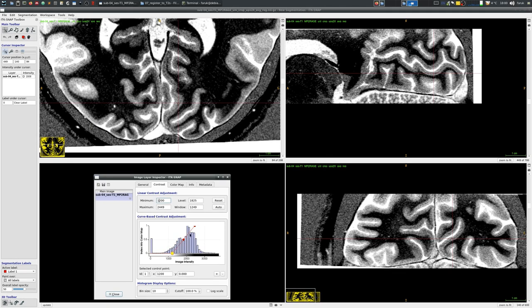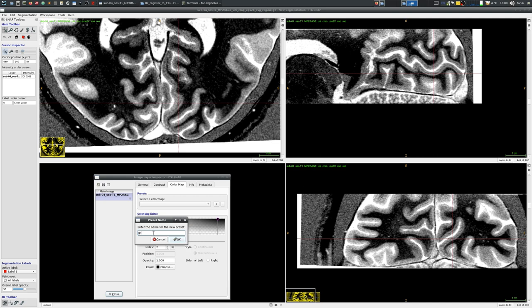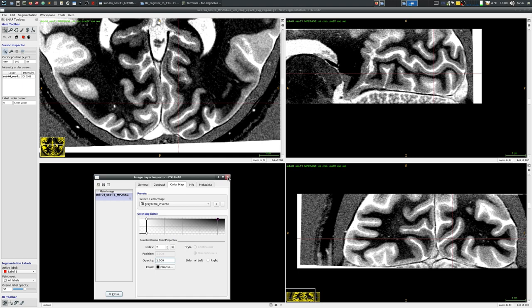The last thing is that we can actually save this inverse color map, which is very handy because you only need to do this operation one time. Then you can quickly change it from the normal black to white grayscale to white to black grayscale reverse option.